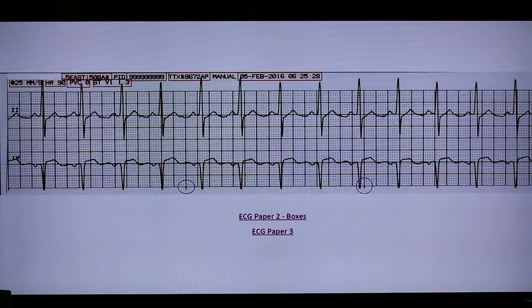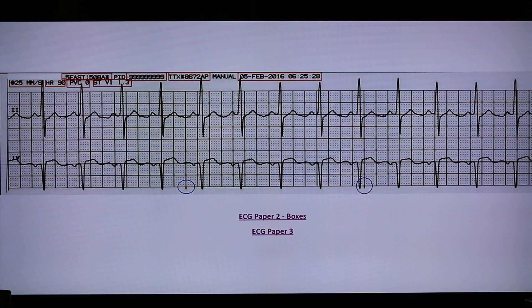In most settings, telemetry nurses are given the classic paper strip at the start of the shift. The paper strip is the printout of Leads 2 and V1, which is often the default leads.